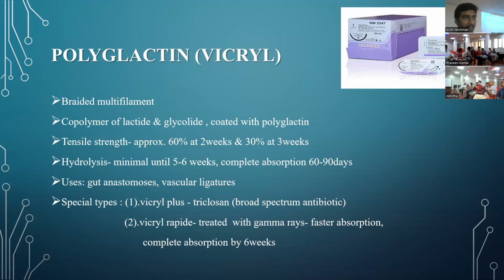Vicryl meshes are available. I suppose it's not available in Nigeria, but it's available. So in patients who have septic abdomen and things like that, if you decided to relook in 48 hours, you don't have to use it. But if you know that you're not going to go back in, you're expecting the problem to persist, then you can close with the Vicryl mesh, because it will get absorbed, and later they may have an incisional hernia and they will treat that. So Vicryl meshes are used in very infected cases. It is supposed to be good that way.